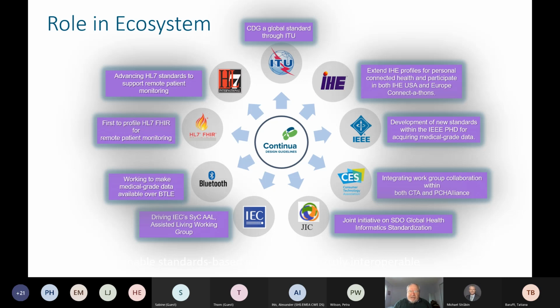What was interesting is that in the collaboration with IHE, if you look at the Continua Design Guidelines, you will see a number of IHE profiles. I believe there are 5 profiles from IHE that have been referenced and reused by Continua. Those were profiles initially designed for within the hospital, but IHE was very careful to design them in a way that they could also be used outside of the hospital, although that was not clear. And that was made quite clear by Continua. So we have been working at keeping consistency between the two. But the new view that we have now put in place is, in a sense, to flip things around.